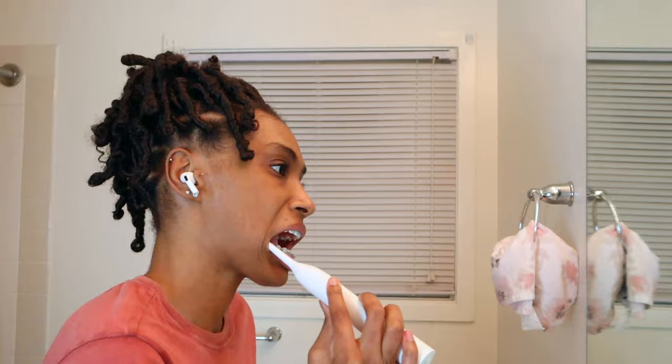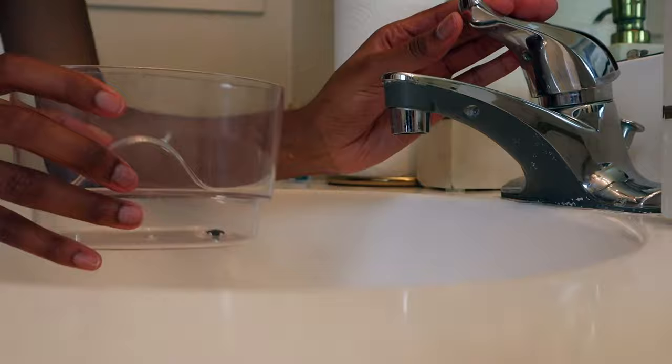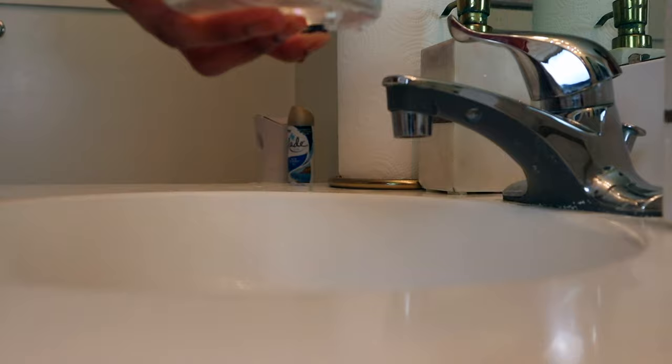I brush my teeth for way longer than that because I just want to make sure I'm getting a really good clean. Now I'm going to move on to my water flosser. If you have braces and you do not have a water flosser, please go get one — this thing is a lifesaver. I'm just going to fill up the tank with some warm water. I like my water to be kind of hot; I feel like if it's hot it gives me a better clean.